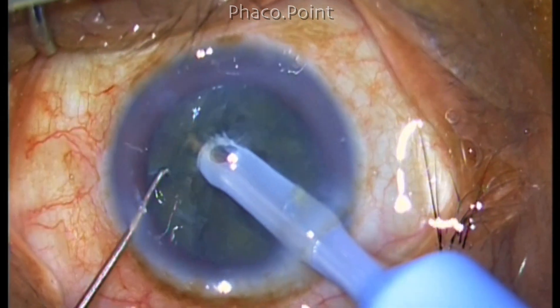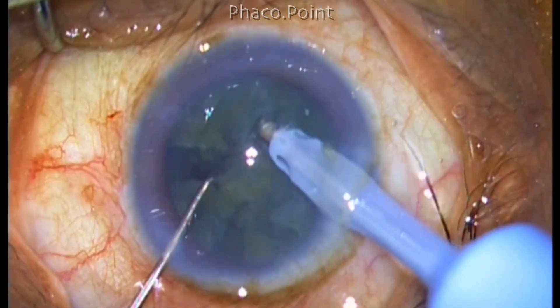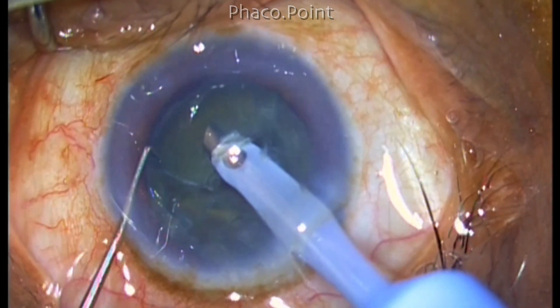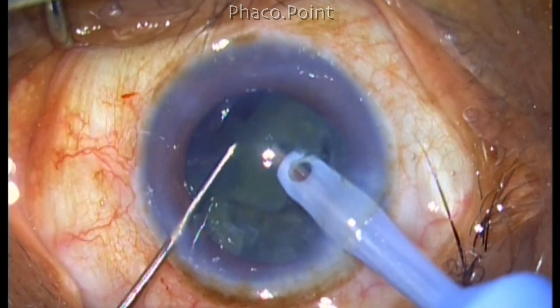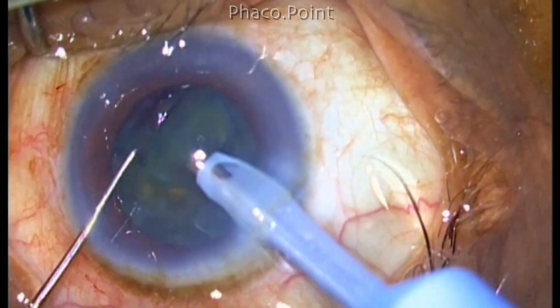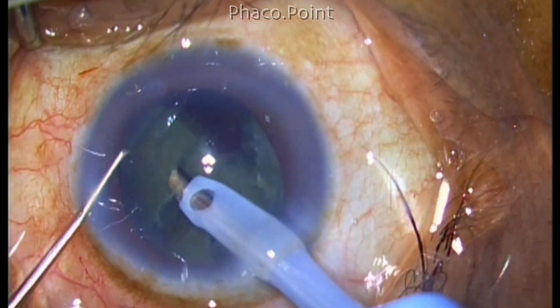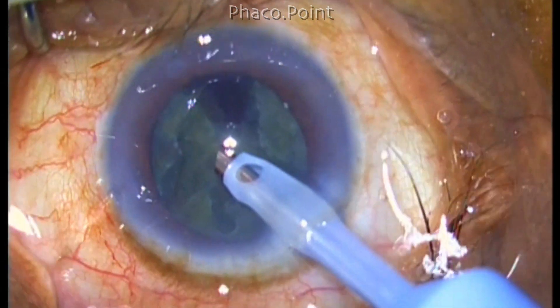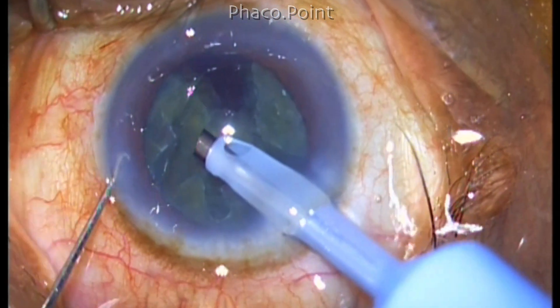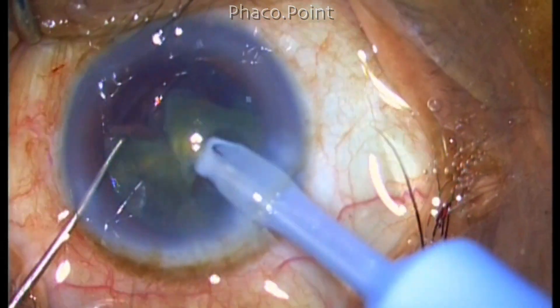I have created a few cracks and made a few areas of good separation of the nucleus. So I hold on to the nucleus fragment with high vacuum, pull it towards the center and using the sharp chopper, I tumble the piece away from the capsular bag and away from the clutches of the anterior capsule, free it, and then emulsify it in the center. I'm attempting to do the same with another piece but it tends to spring and fall back. So I switch the second instrument from a sharp tip chopper of 1.5 millimeters to a Sinski hook because the maneuverability will be much better.